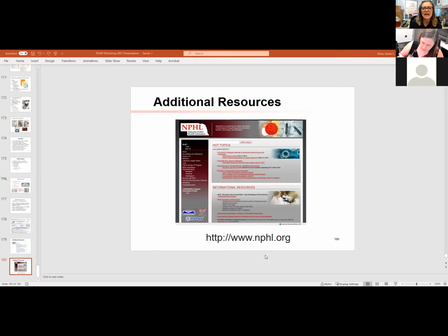So they really want you to kind of narrow it down to one of those families we talked about. Is it a gram-positive rod, like Bacillus anthracis? Is it a gram-negative rod, like Yersinia, Burkholderia pseudomallei? Or is it that last weird group that's so small, it's hard to read, and that'd be Francisella, Brucella, and B. mallei. So you can say suspecting BA or suspecting Yersinia. So doing that LRN will help you bring it down to one of those possible cases.